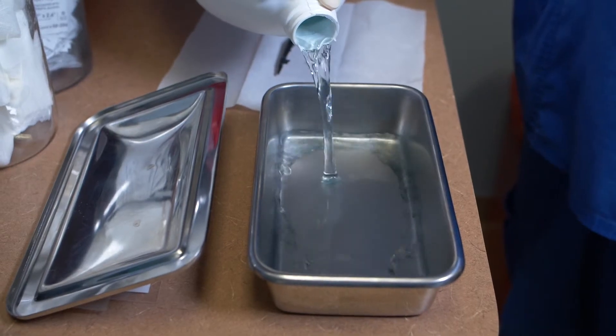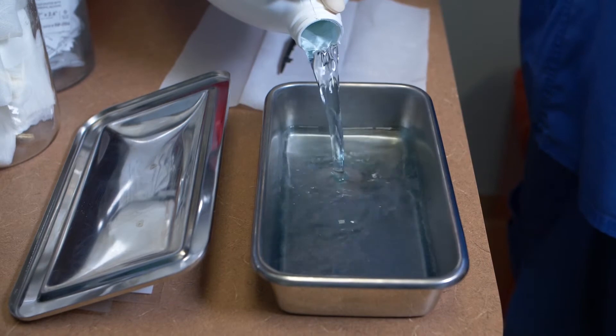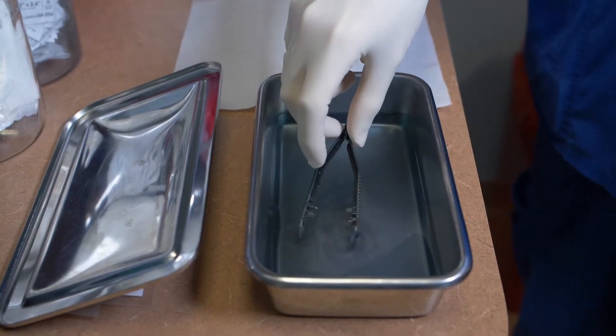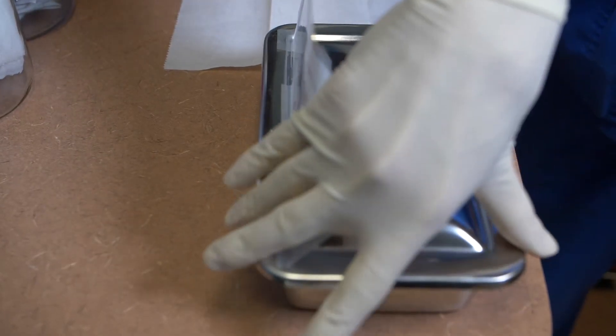Put on the heavy-duty gloves. Pour the solution carefully, trying to avoid splashing, into a container large enough to accommodate the instrument or instruments and to allow complete immersion in the sterilization solution. Place the sanitized and dried items into the solution, completely submerging them. Close the lid of the container.